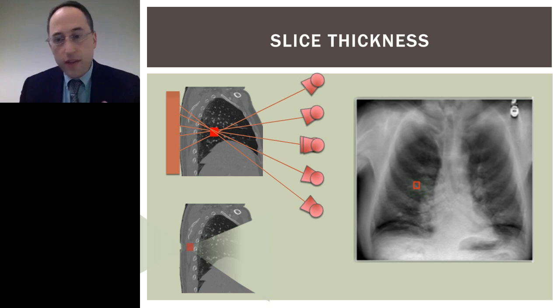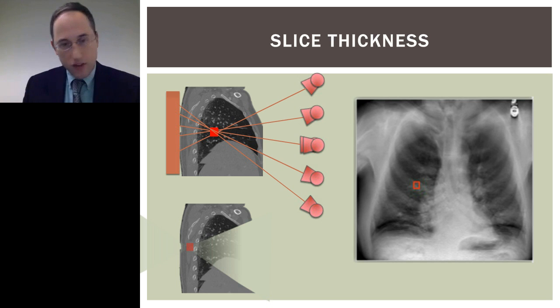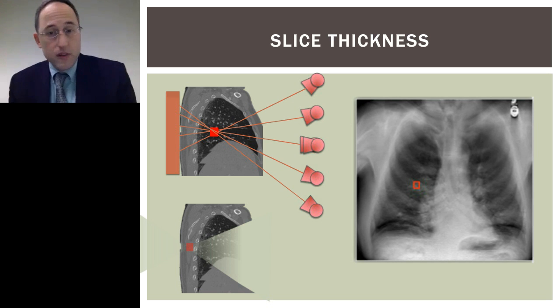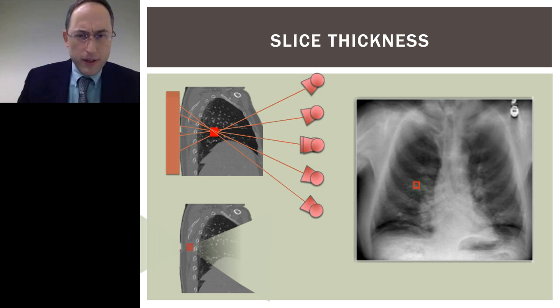Now, there are some inefficiencies in the system, and of course there are some limitations because you lose dose as you take multiple projections. So in the end, the dose ends up being about twice that of a radiograph. But the point is that you obtain a signal to noise ratio with a far lower dose on tomosynthesis than you do on CT. And that's why tomosynthesis is a low dose modality, relatively, compared to CT. We'll talk about it a little more in detail.